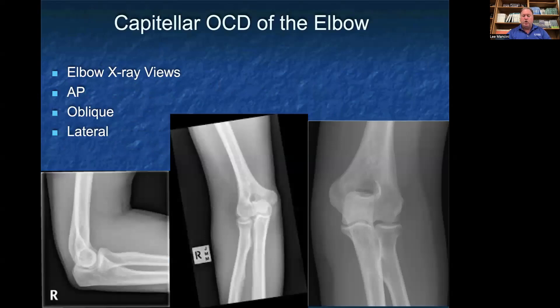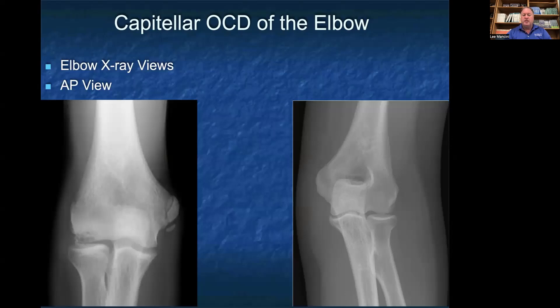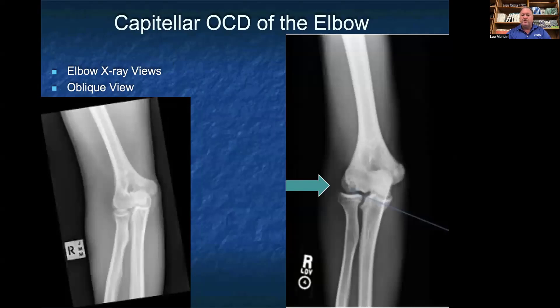The last one is a capitellar OCD of the elbow. Typically we get three elbow views for x-rays of the elbow: an AP view, an oblique view, and a lateral view. The AP view is on the far right, the oblique view is in the middle, and the lateral view of the elbow is on the far left. On a capitellar OCD, you're going to see the capitellum on the distal aspect of the humerus, at the radiocapitellar joint opposite the radial head. On the right you have a normal AP view, and on the left you can see that lucency on the capitellum consistent with an OCD. On the oblique view, the left x-ray shows a normal radiocapitellar joint, while on the right the bluish-green arrow points to the irregularity of the capitellum and the OCD.